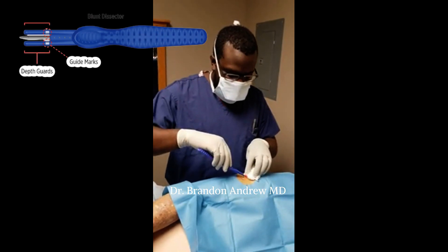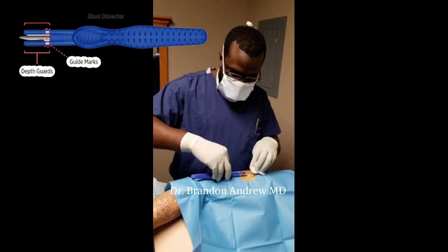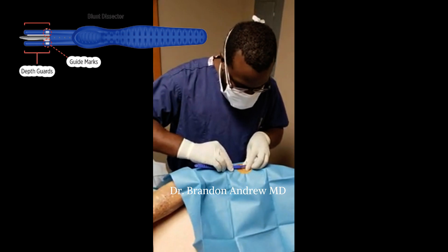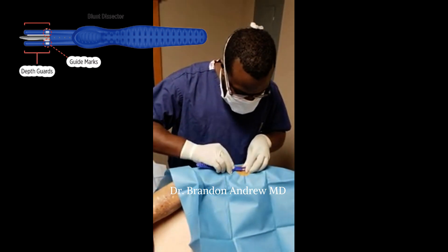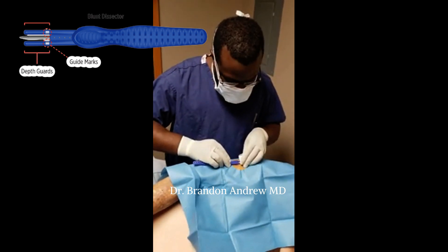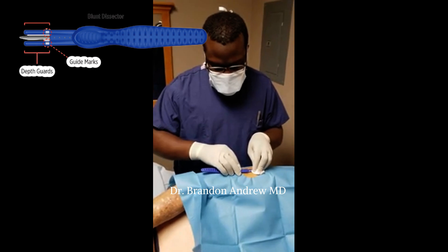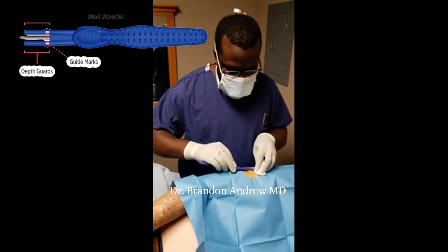Creating the subcutaneous pocket is a key step. Insert just the tip into the incision and then lower your hands so that the blunt dissector is parallel to the skin. From there, insert the blunt dissector into the incision, wiggling it back and forth along its long axis but not fishtailing. You want to create a nice cylindrical pocket parallel to the skin. Use a screwdriver motion to advance the blunt dissector. This is a key step to ensure good sensor signal and ease of removal. Hold the blunt dissector in place to help achieve hemostasis. Once you've removed the blunt dissector, again hold pressure to achieve hemostasis — don't move on to the next step if there's any oozing.